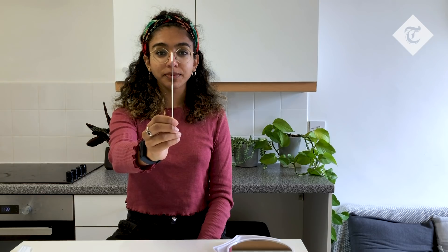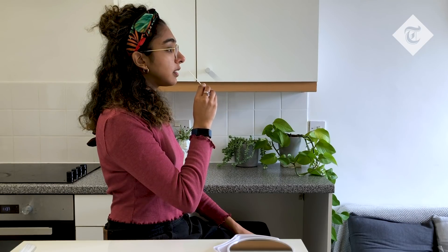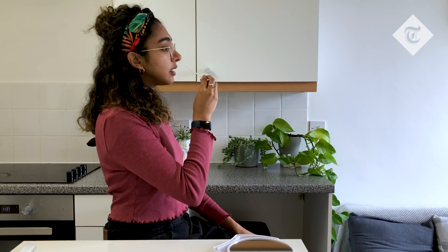Taking a sample from the nose, push the swab gently up your nose until you meet resistance. The movement is more towards the back of your head rather than directly upwards, and once it's in there turn it around five times in each nostril.